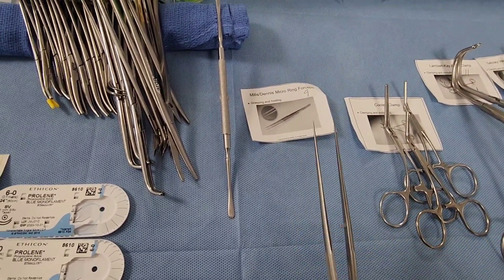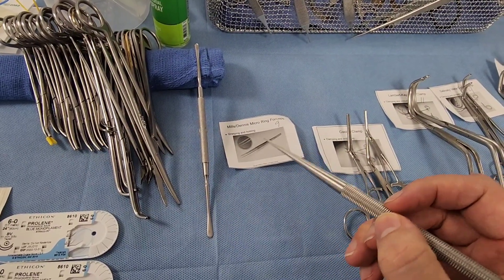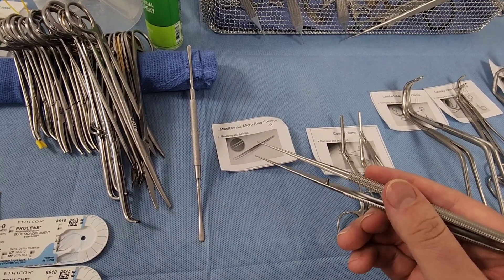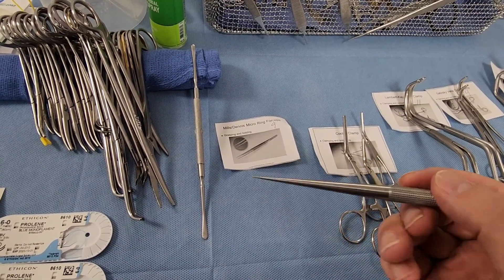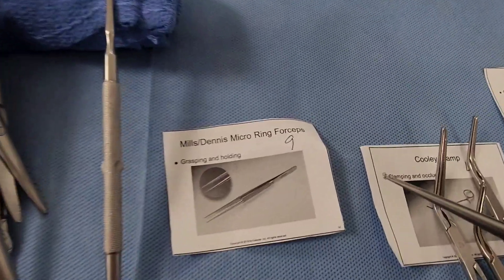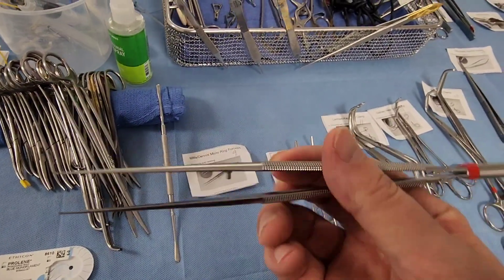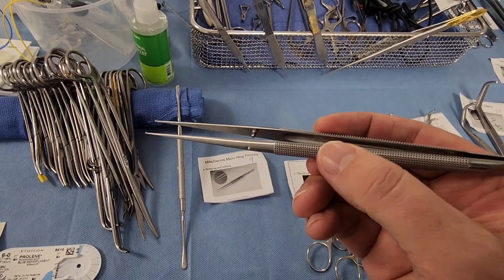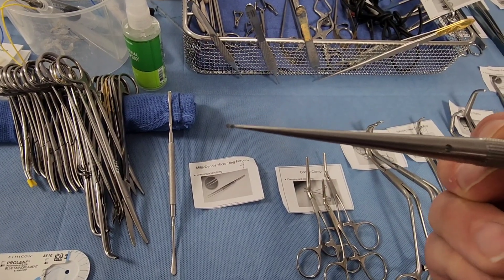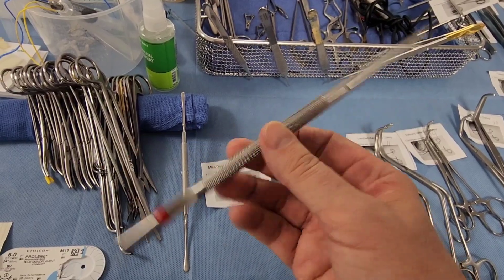Let's go over some instruments. This is the Mills-Dennis forcep, typically used for stripping plaque or atherosclerotic material off the intima of vessels. It's a ring forcep that's very fine. Also called the Mills-Dennis micro forcep, it's used a lot in carotid surgery for stripping plaque off the intima.